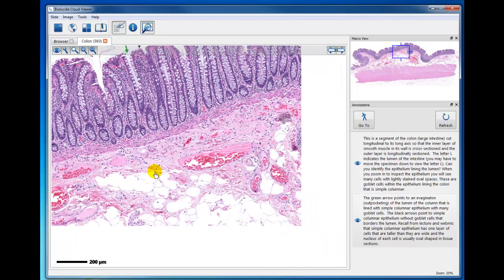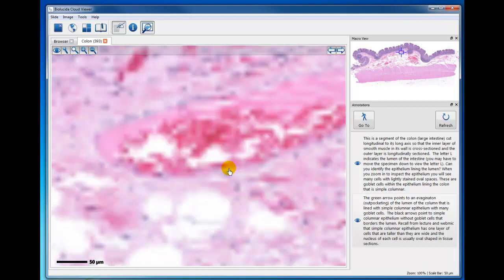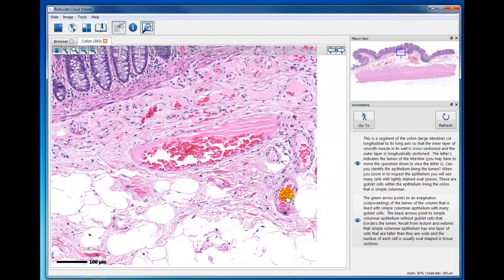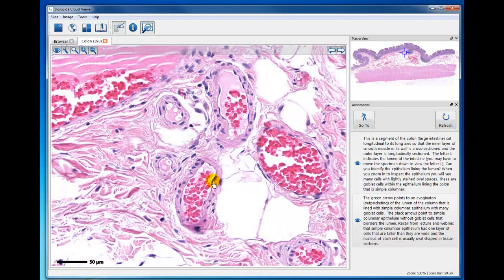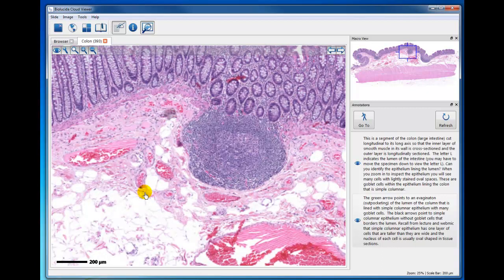Okay, so I hope that that's helpful as you think about epithelium, because you're responsible for the epithelium now. And you know, in lining the blood vessels, you have flattened cells, as evident by that nucleus here. And then there are other blood vessels over here. You can see a flattened nucleus here, another one here. You can see it very well here. This is simple squamous epithelium, which is called endothelium within the blood vessels. And of course out here is collagen and connective tissue, and then adipose tissue.